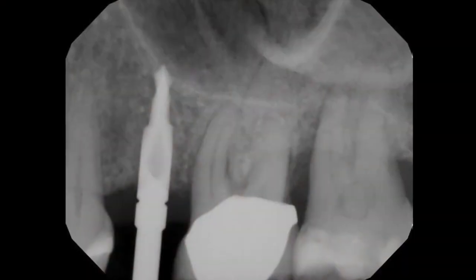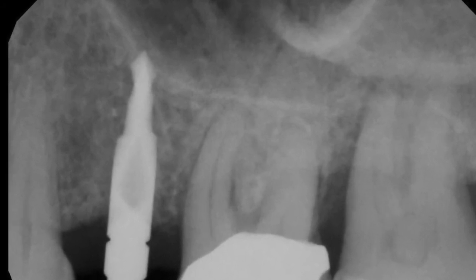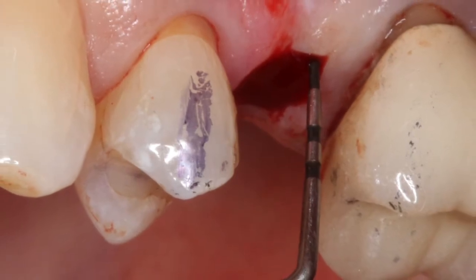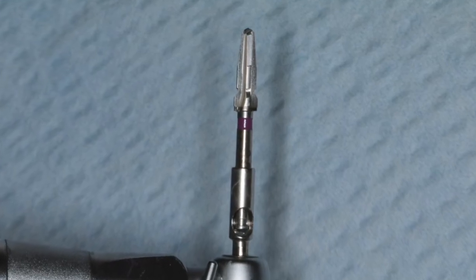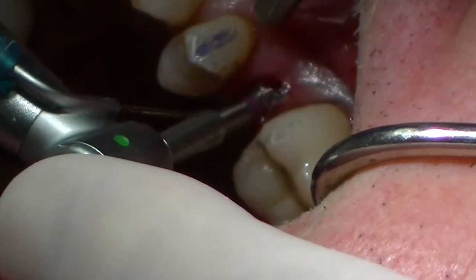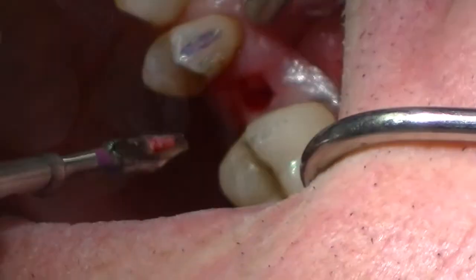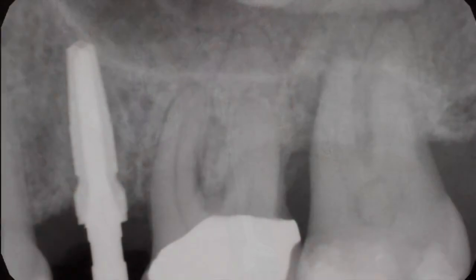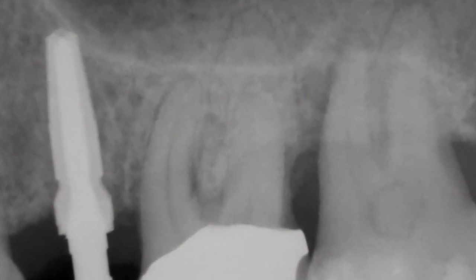I'll simply take a radiograph to see that I am at the floor of the sinus. We have about 3 millimeters of soft tissue. I'm simply going to widen that osteotomy site with the 3.5 diameter tapered burr, going at 800 RPMs to the floor. Taking a radiograph, you can see I'm at what I consider to be the floor, but the burr is not completely at depth, which is fine in this situation.